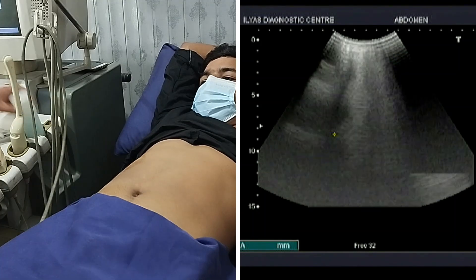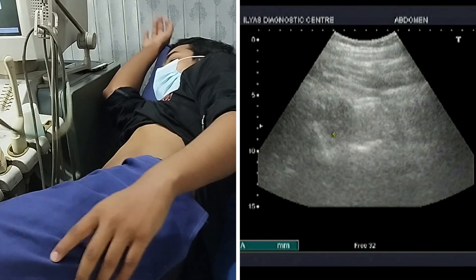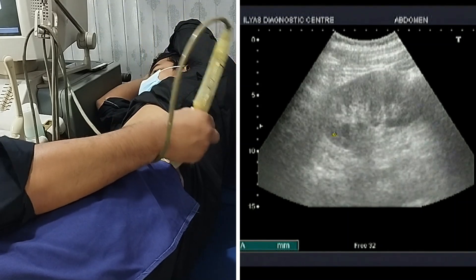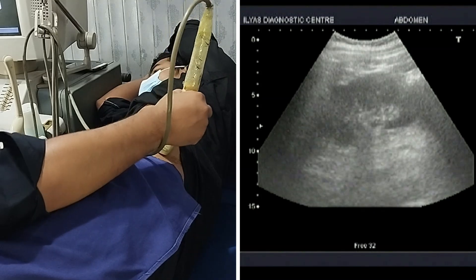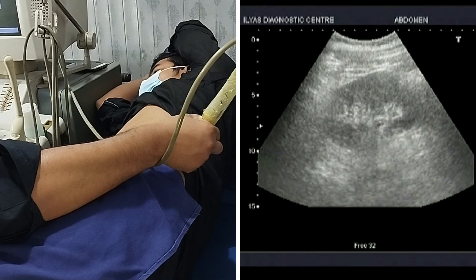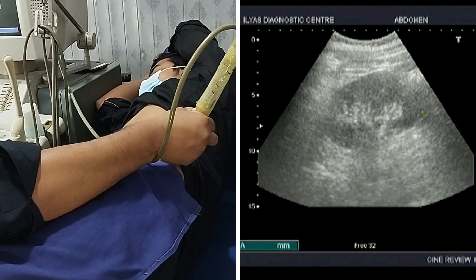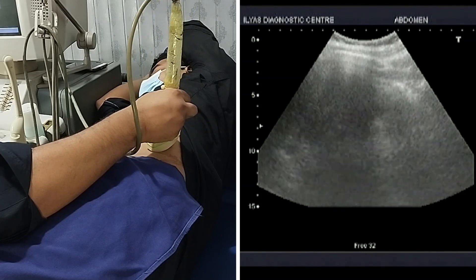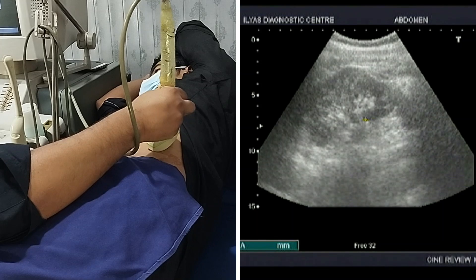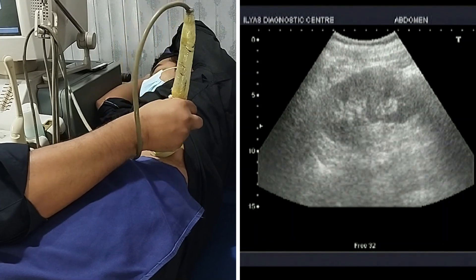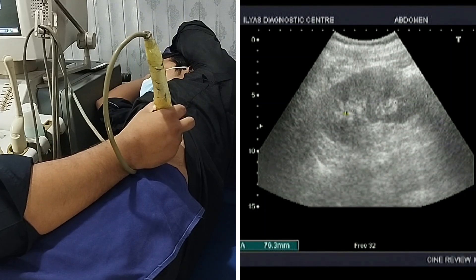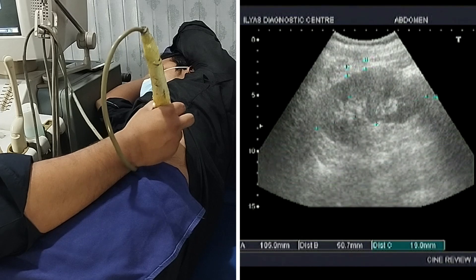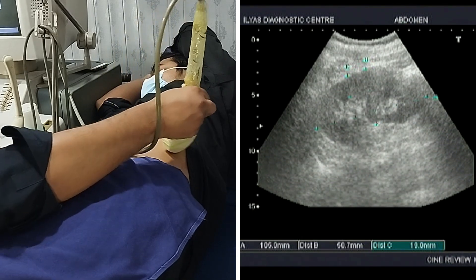Now I will ask my patient to turn toward me, that is on the right side, and I will put my probe in the left lumbar area. I will ask my patient to take a deep breath. It is just like the same direction as when I placed the probe in the right hypochondrium to visualize the liver. By putting my probe in the left lumbar region and tilting it a little bit anteriorly and superiorly, the left kidney will be visible. Here I will measure the left kidney — my probe is at the same point and I have not changed the direction.